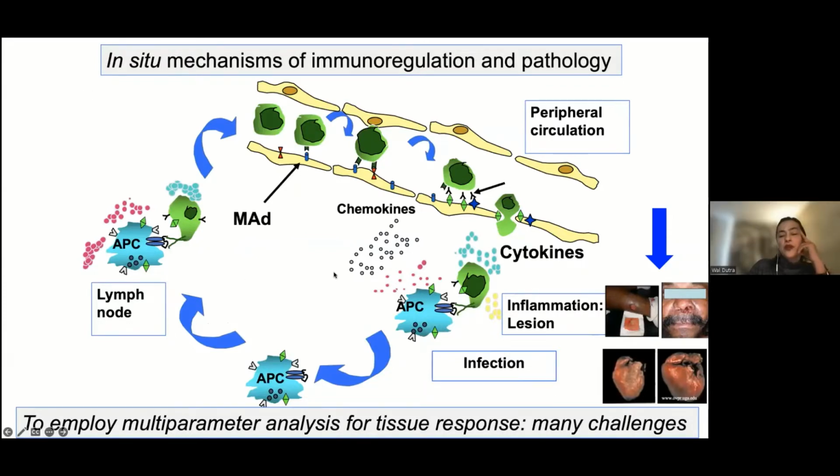So, when you think of using fluorescence to identify different cells and components present in the site of tissue destruction, and if the material that you have is paraffin-embedded tissue, this really poses many, many challenges to us. And that's what I wanted to discuss with you today. Thinking about that, I can tell you that since many years ago, we have tried extensively doing multi-parameter fluorescence in tissues from paraffin-embedded repositories, and it really has been a major tragedy. We were incapable of doing that.